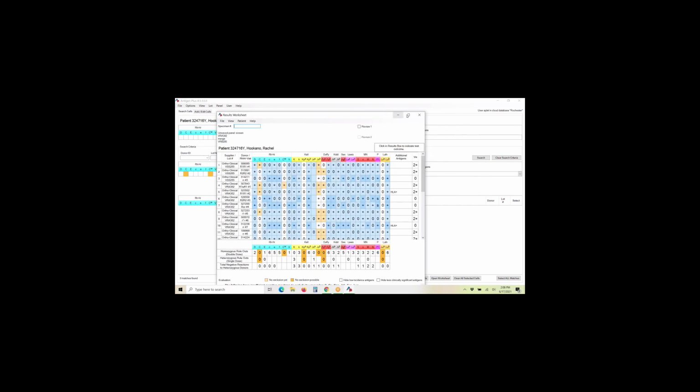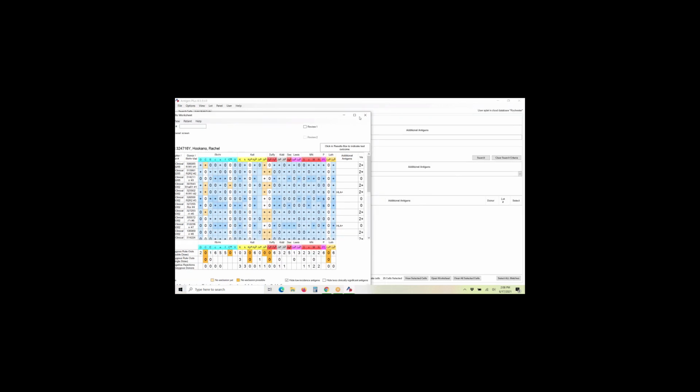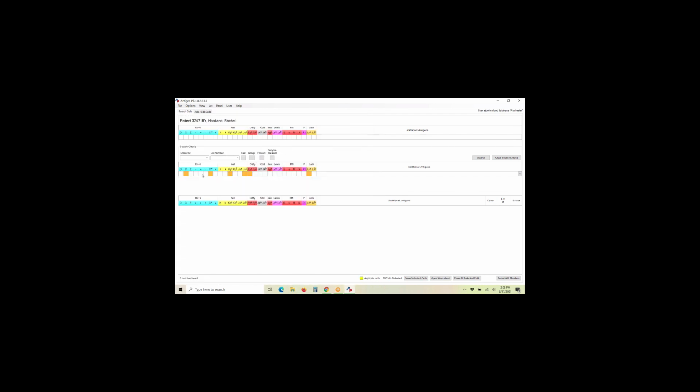And once it's merged, you probably guessed it already. We have the same issue with JSB. So it really didn't improve our situation. We're still looking at that JSB there. So what we would do is we would just go ahead and say, you know what, let's close this and let's look for a manual cell. I know on Vision, I believe you can run one cell at a time.